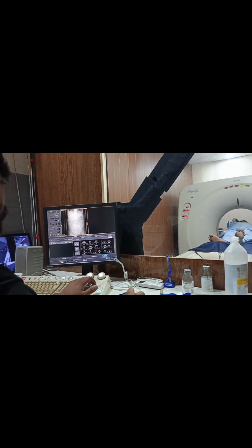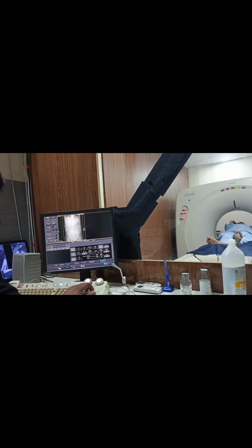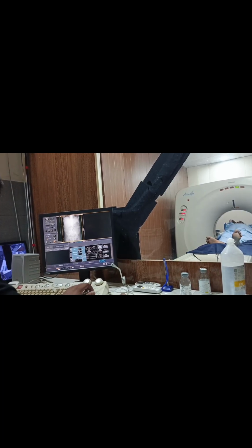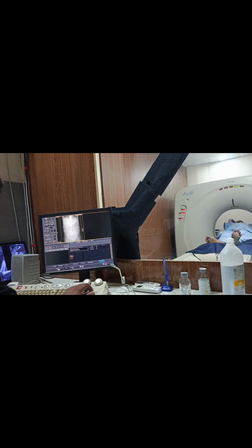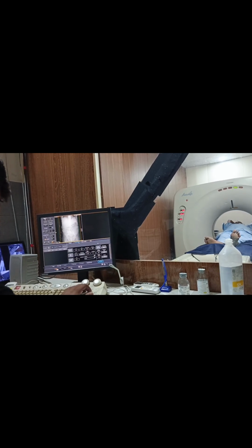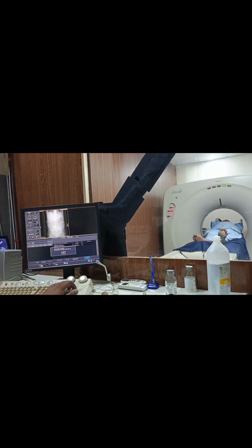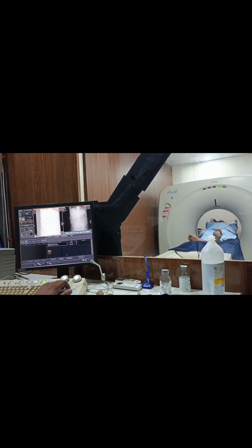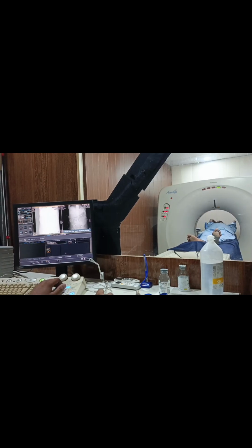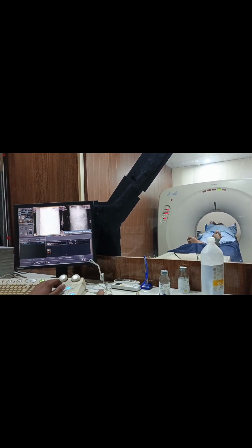Modern CT scanners use advanced technology such as multi-slice or helical scanning, which allows rapid data collection and high-resolution imaging. In just a few seconds, hundreds of slices are obtained, capturing fine details of organs like the liver, kidneys, pancreas, spleen, intestines, urinary bladder, and reproductive organs. The system uses sophisticated algorithms to reconstruct these images and display them on the workstation monitor.